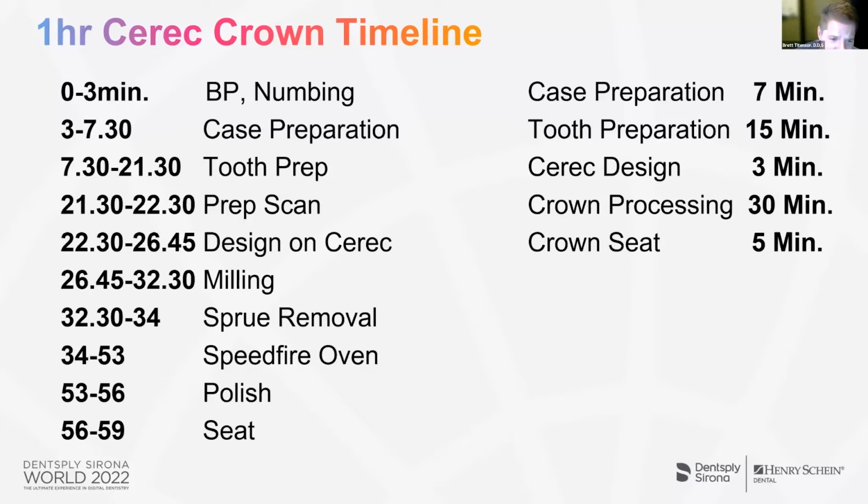15 minutes, I do say if anything you're going to slow down and take your time on is the preparation, the tooth prep. If you give a CEREC a really good prep and a really good scan, it can produce amazing results. Where I think people have trouble is if maybe they rush the prep, they don't define the margins well, it's not a smooth margin, they don't get enough clearance. That's another big issue. So I'm thinking taking the time on the prep can make all the difference in the long run.